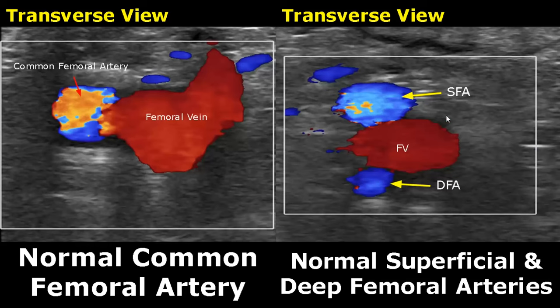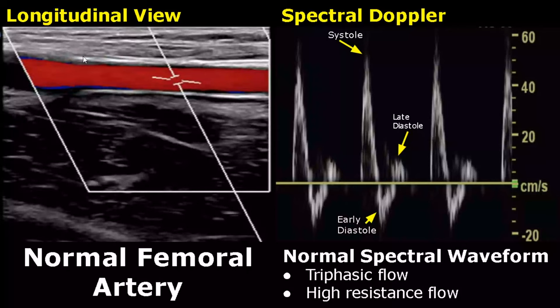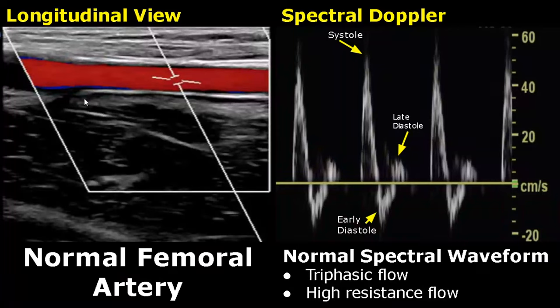Color Doppler is applied and the arteries will be seen pulsating. Here is a longitudinal view showing normal femoral artery with no obstruction. This is the normal spectral waveform of the femoral artery — a triphasic high-resistance flow. We see a sharp systolic peak with some flow reversal in early diastole and forward flow in late diastole. The peak systolic velocity can be around 60 centimeters per second.